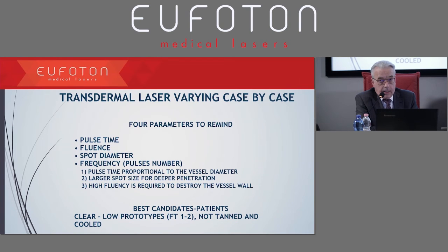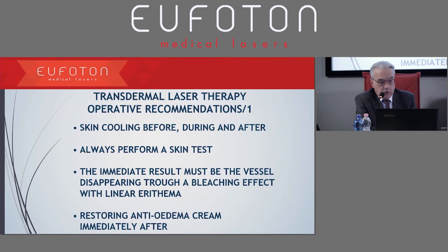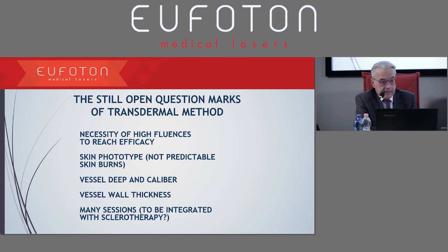Hence, when we treat with transdermal laser, we have to check the pulse time, its fluence, spot diameter, and its frequency. Of course, like all laser treatments, low phototypes or clear phototypes are the best candidates from this viewpoint. I'll skip these ones.